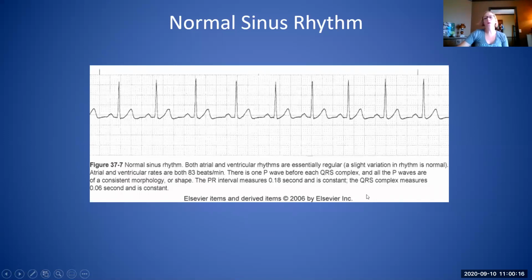One other slightly more precise method is the big block method. The big block method is pretty simple too. All we have to do is count the number of big blocks between each QRS. You take two QRSs, count how many big blocks are between them, and divide into 300.